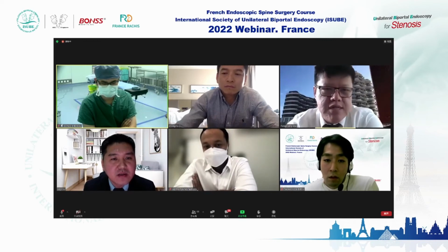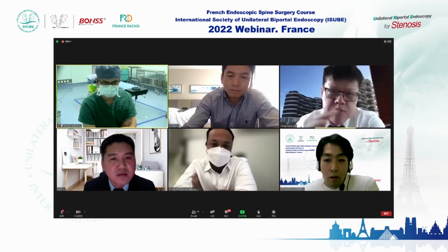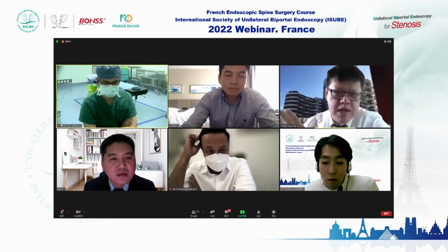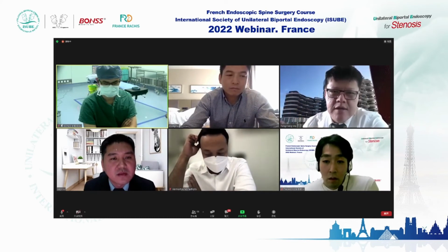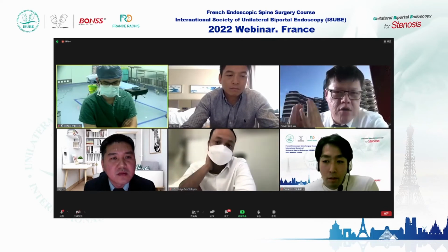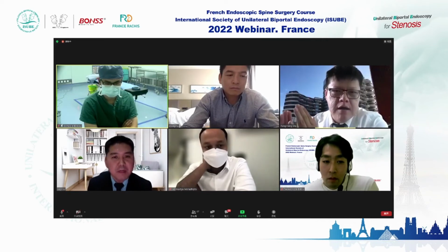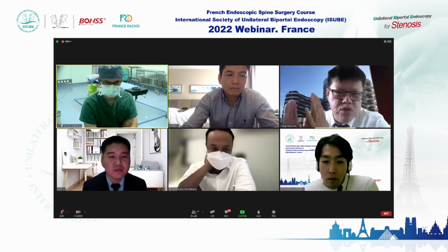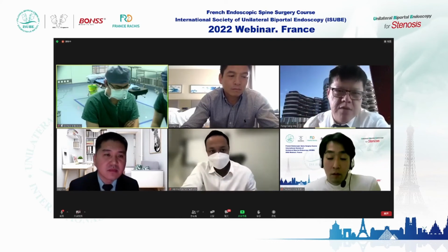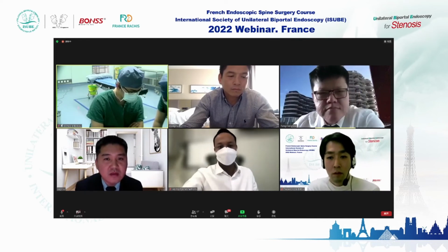There's a lot more interest now in the younger generation. I think they can choose between tubular, because they start fresh, right? They just graduate and become spine surgeons. Then they have to decide, if they do MIS, whether they want to do tubular or scope. Quite a number choose between uniportal or biportal, and quite a number choose biportal because the learning curve may not be so steep. So that's the reason.